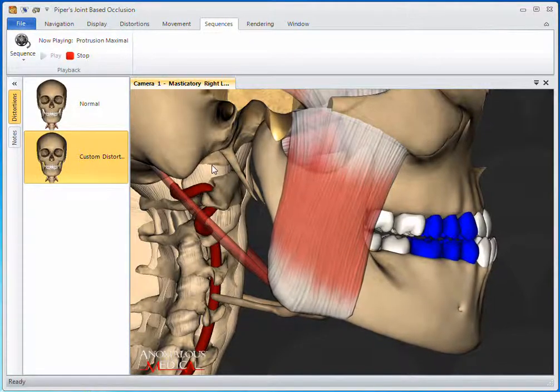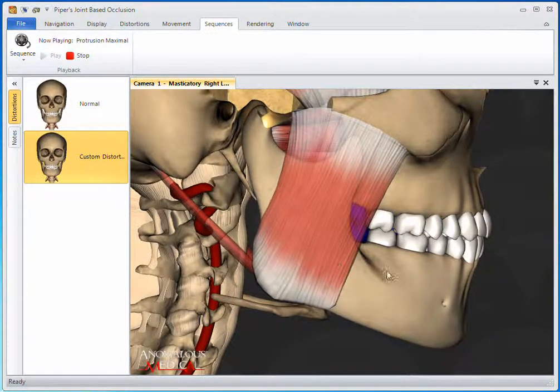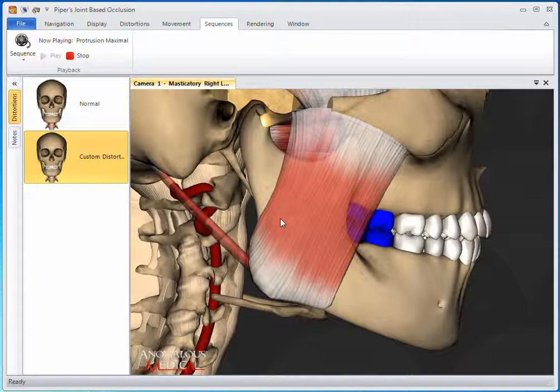The Show Occlusal Contacts feature helps to highlight the way these changes affect the occlusion of teeth.